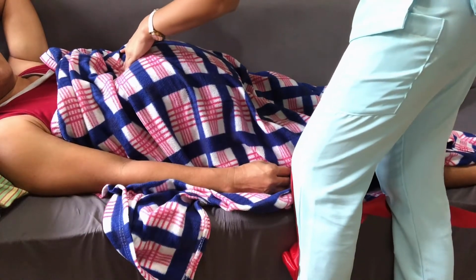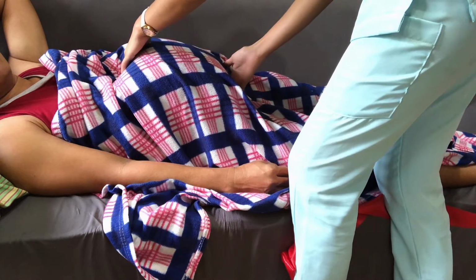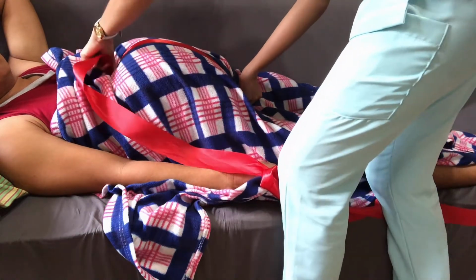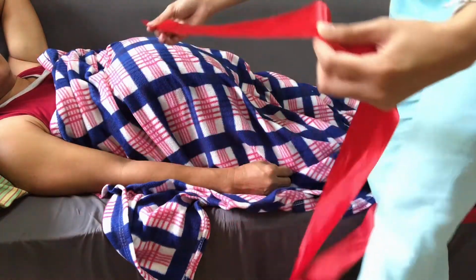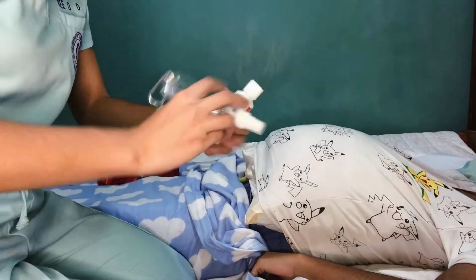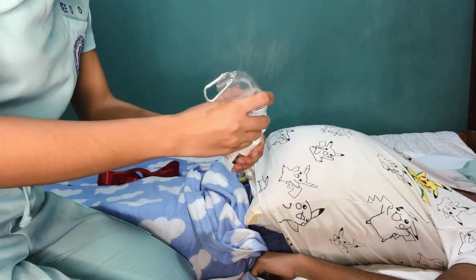Palpate the fundus of the uterus and the upper border of the symphysis pubis. The tip of the tape is placed on top of the superior border of the symphysis pubis and extended cephalad towards the uterine fundus. Measurement in centimeters is recorded. Locate the fetal back by gently palpating the mother's abdomen for a firm area. Apply lubricant gel to the Doppler probe and listen for the fetal heart sounds.